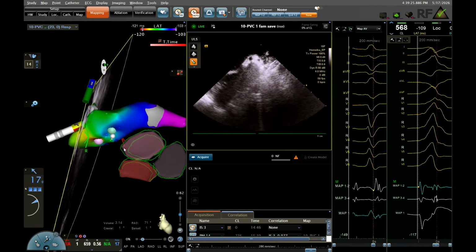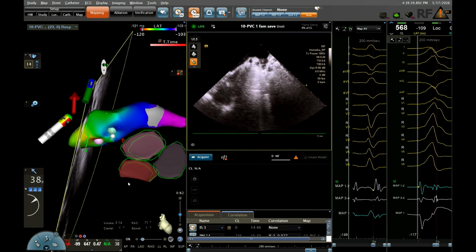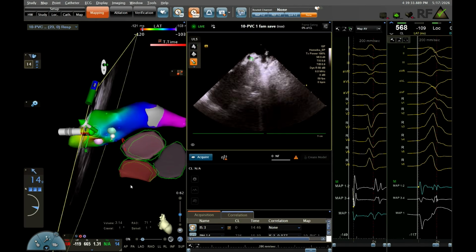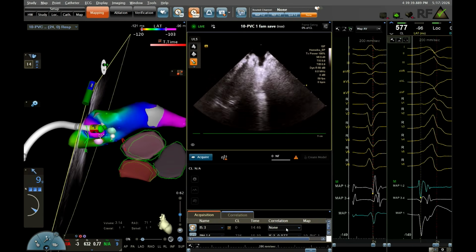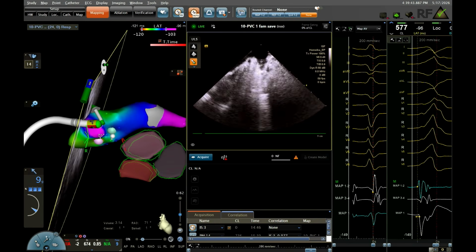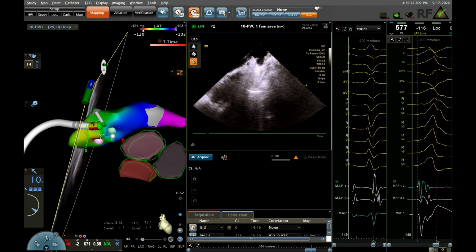You want to show the live ECG as well. Yeah. That's a PVC there. Show the activation. Yeah, show it to them. Update the timing. The distal is coming back. That's good. So we're going to show you.